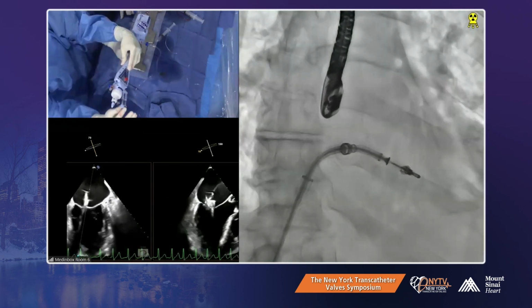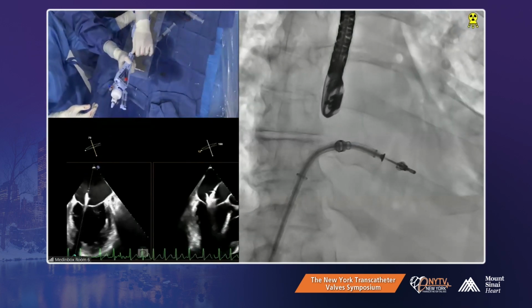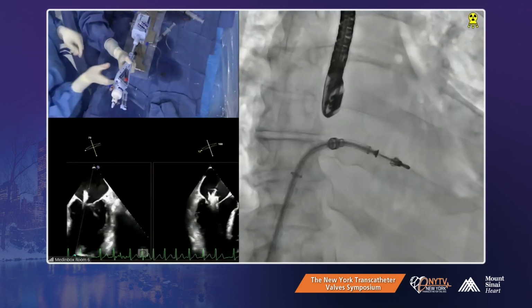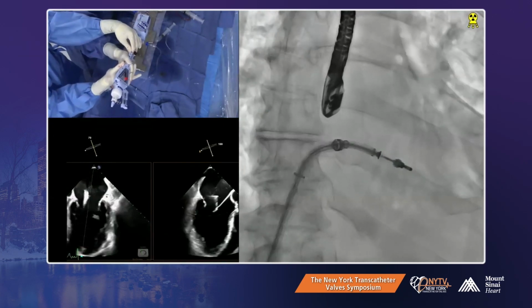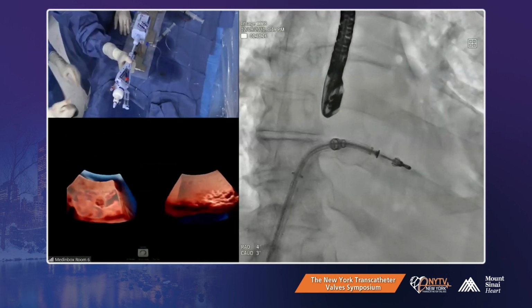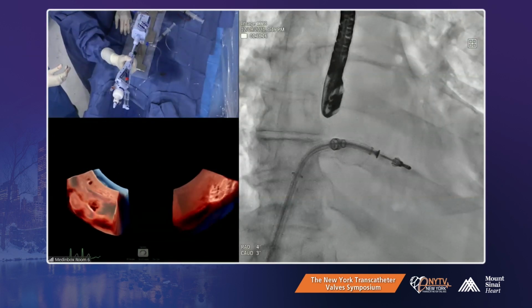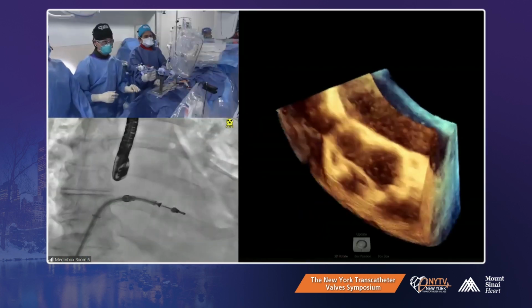Okay, so we relatch and then let's do 3D now to check our orientation as you guys mentioned. Please, let me just jiggle more. 3D would be interesting. Okay, there we go. Take the true view off. And anesthesia, if you can help us, Benji, slow down the heart rate, it will be really helpful to our grasping.